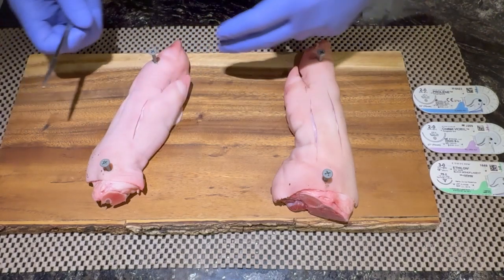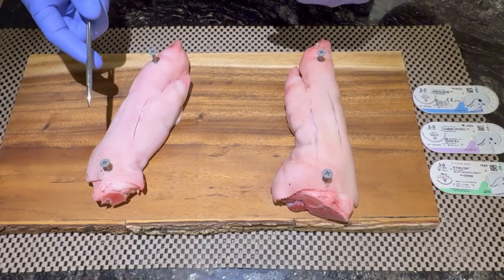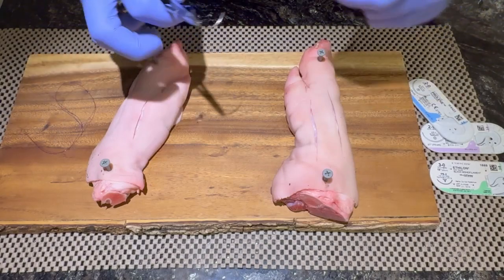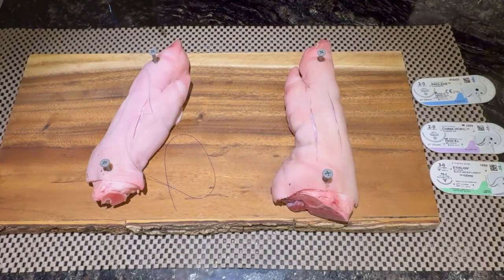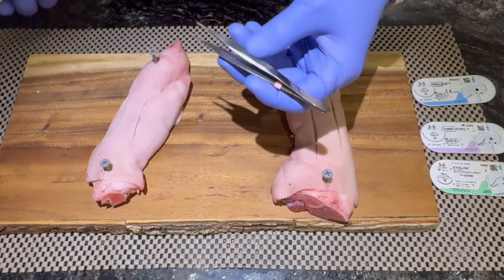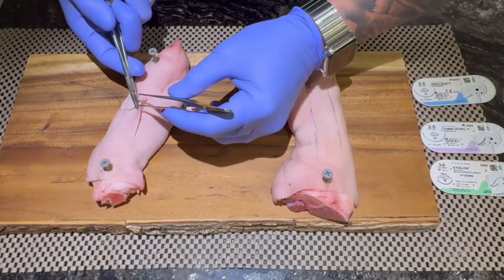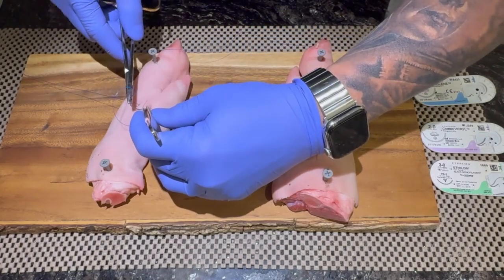It's decontaminated. It's clean. It's a non-contaminated area. Then we proceed to suturing the wound. In this case, we're going to be using a needle holder and a suture. This is a Prolene suture, a permanent monofilament suture, and then we use a needle holder and a pickup. We lift one side of the skin.